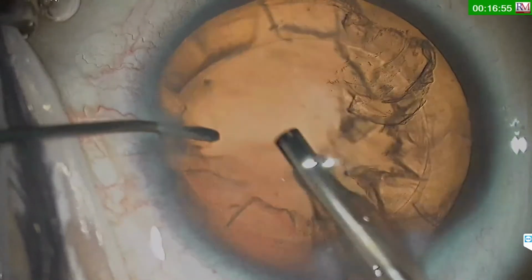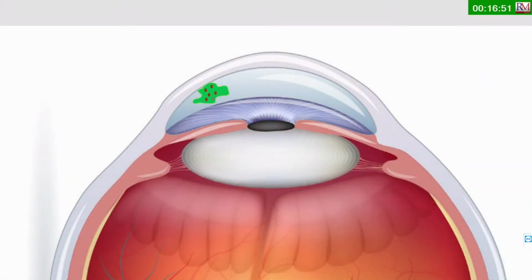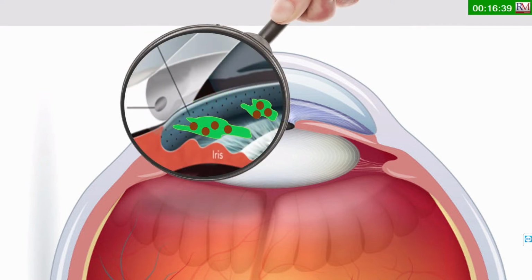Actually, they are not sticking to the endothelium, but are contained by the viscoelastic. If we have a bolus of viscoelastic, it will definitely have microfragments that were shot inside it. If you magnify and look at the trabecular meshwork, with time the viscoelastic will disappear and absorb, leaving behind, like a sieve, some microfragments that will stay there and cause recurrent uveitis to this patient.